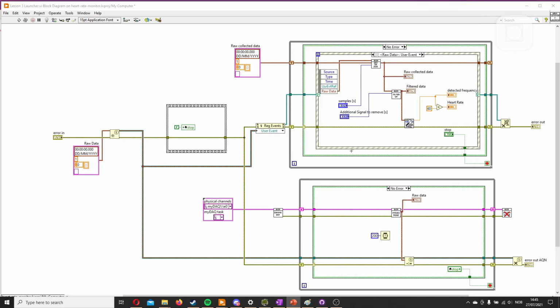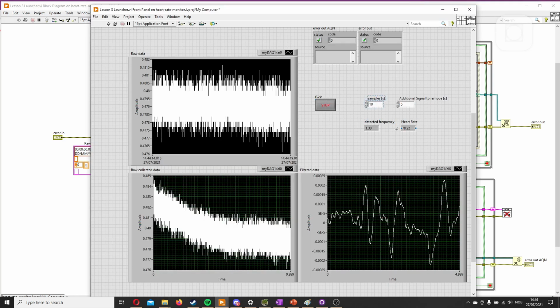That's it for lesson 3-1. We separated the hardware out and set up a communication between the loops, making it possible for them to run in parallel. We also set up a local variable here to stop both loops when you want one to stop. In the next lesson, we will separate out the graphical interface, the buttons and indicators, out from the processing.